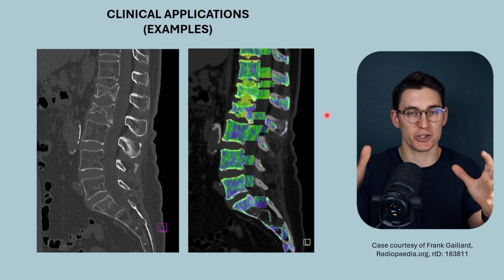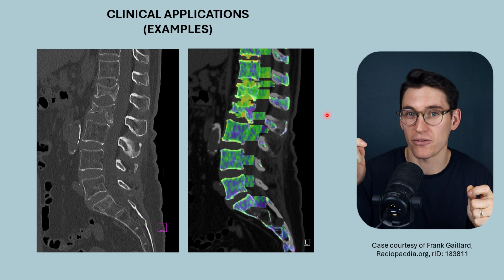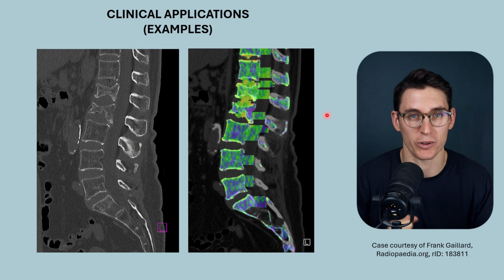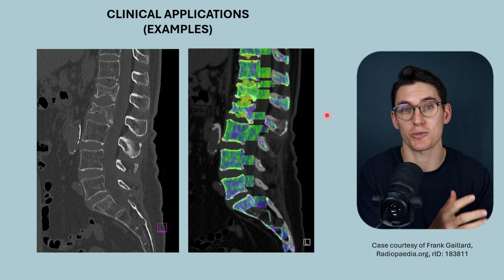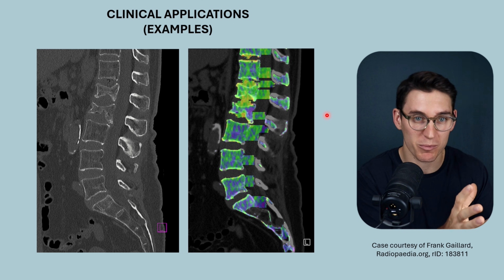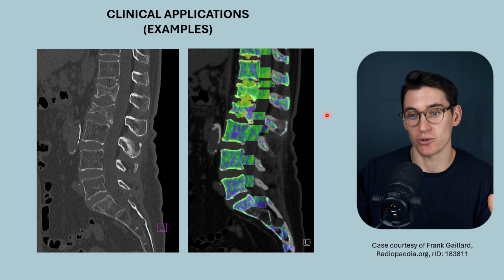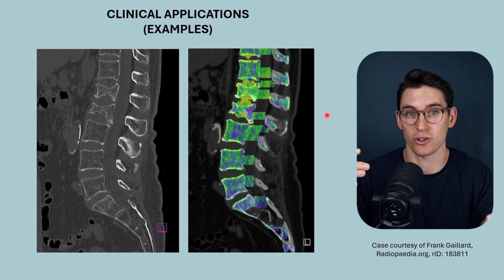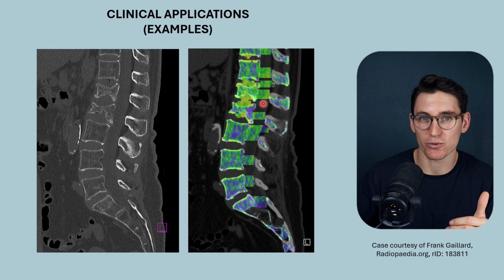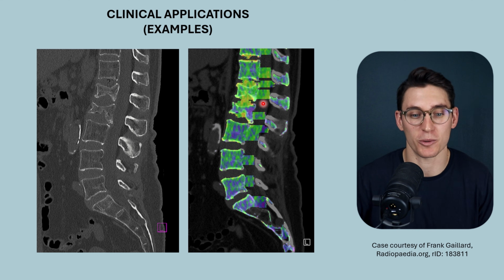The possibilities for dual energy CT are seemingly endless, but whether they provide enough clinical value to justify their increased cost is an ongoing concern. It costs a lot more. The machines that acquire dual energy CT images cost a lot more than your basic CT machines. You need special training for your radiographers, for your radiologists to be able to go through the data sets and know what they're looking at. And that's perhaps an explanation for why dual energy CT has taken longer to be globally adopted.